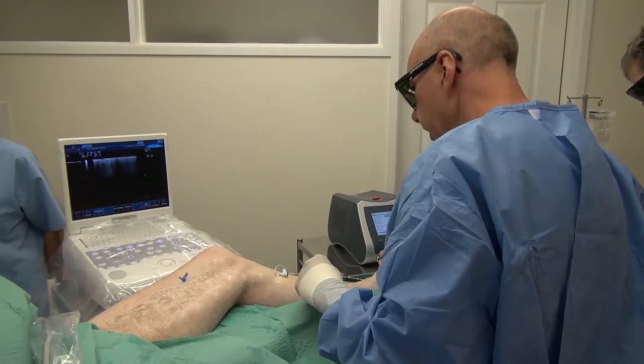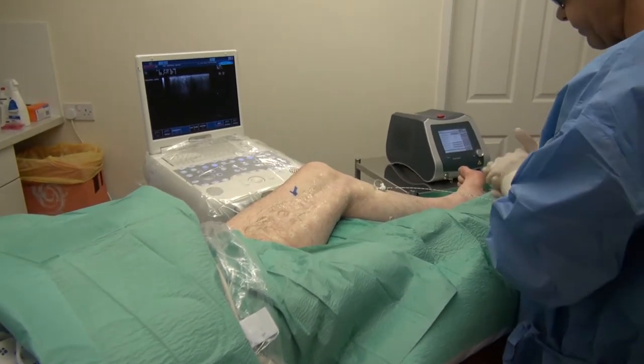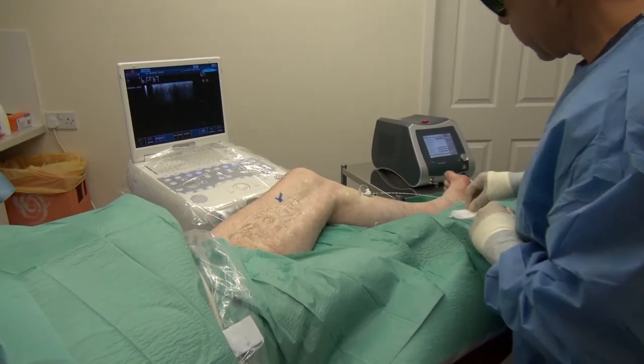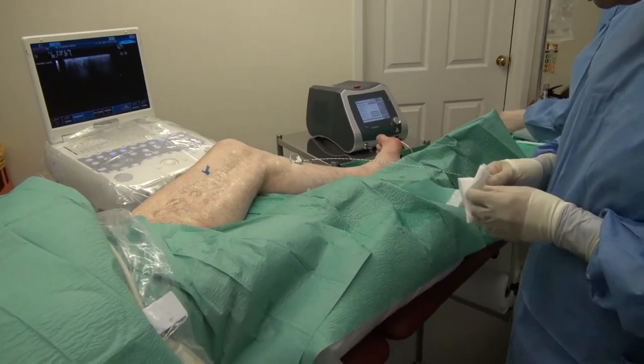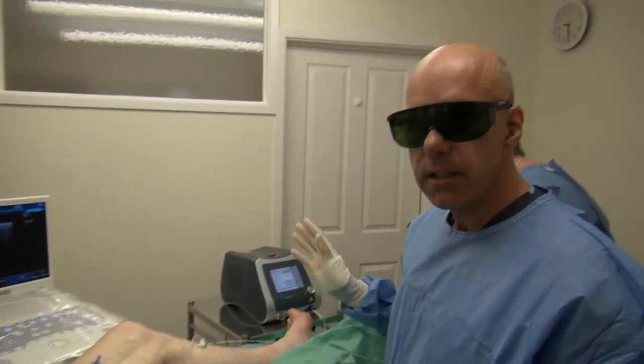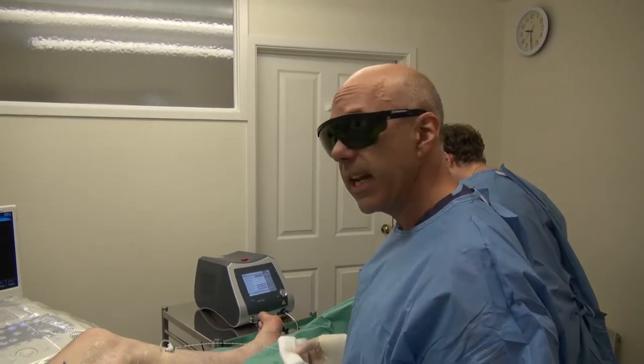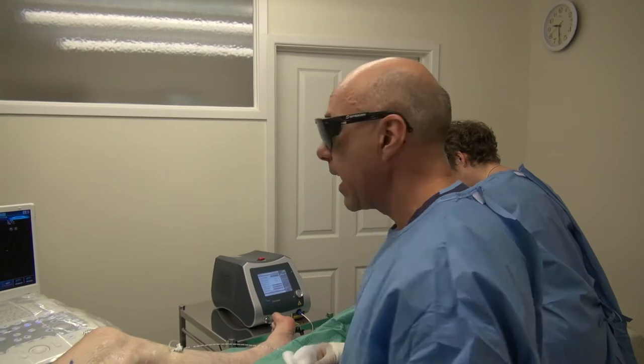So we're now going to deliver energy. Jane has checked the power settings on the machine and called them out to make sure we're all aware of the power settings. She's made sure that the doors are closed, that the sign outside says do not enter — there's laser in progress — that we're all wearing laser safety glasses, and she has pressed the enable button.